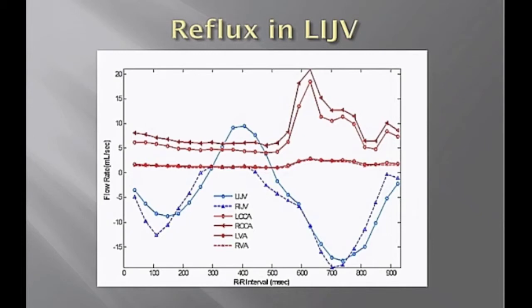It smoothly comes down here during diastole and smoothly goes in the wrong direction and then comes back and increases its speed back towards the heart again, with a little delay between systole of the arterial side and the venous side. Of course, there's going to be some delay, on the order of, in this case, each of these being 40 milliseconds, maybe 100 millisecond delay on the venous side. So this shows you very nicely what we would call reflux here.